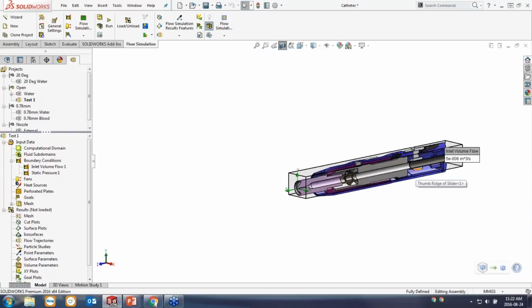Got a question in here. Does it matter what side of the lid I click the boundary condition on? That's a great question. It absolutely does. I want to click on the inside of the lid. That's the side that's adjacent to the fluid. So we're ready to run here. I can go ahead and run this analysis, and I'll be ready to get some results.